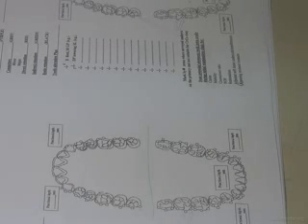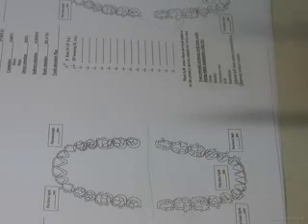Usually the freni. So I need to stretch the frenum very well, and then take the depth, if I'm going to put an I-bar there. Okay? In the lower lingual area, for selecting the major connector, I need to raise the tongue anteriorly to see the lingual sulcus depth. Okay? So this is called functional depth. Not to forget that I put it down in the areas where we usually have our I-bars going, or gingival approaching bars altogether. Okay?